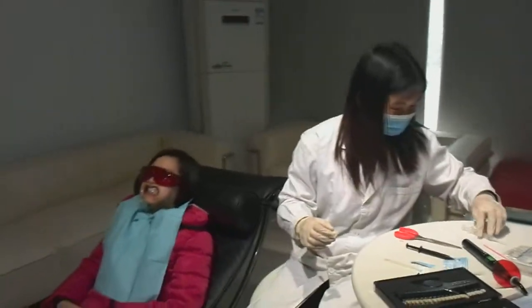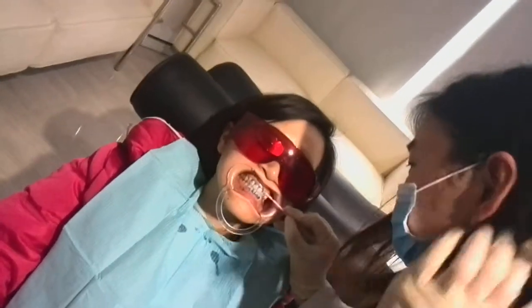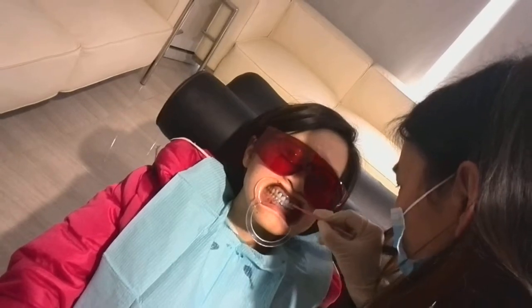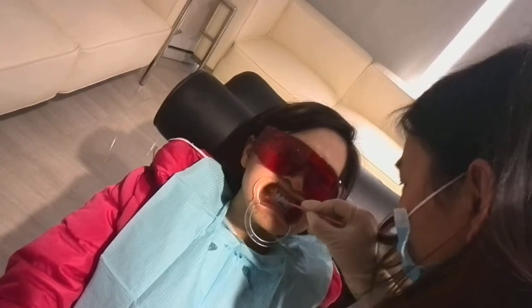Then we can put the gel on the teeth. Evenly and fully covering is the key point. Put the teeth whitening light to the teeth. Set up the time.